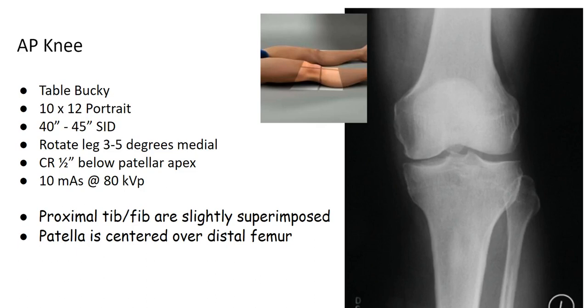So looking at this x-ray, first things first, I know this is a left knee because my fibula is a lateral structure, my tibia is a medial structure. So if this is hung correctly, this has got to be a left knee if I'm talking to my patient. Okay? How do I know this is an AP?